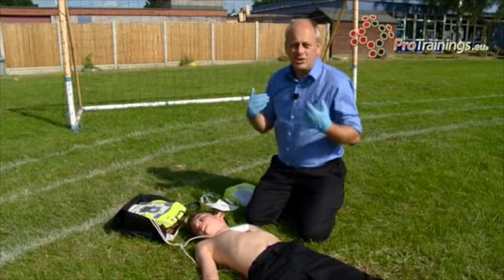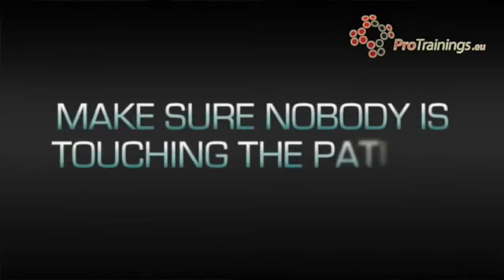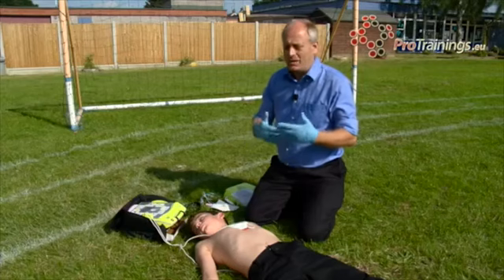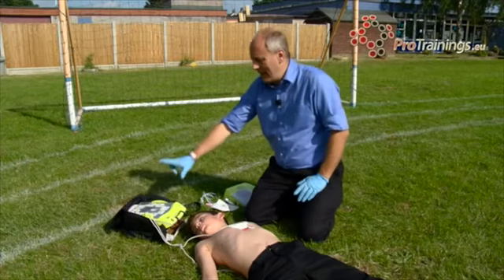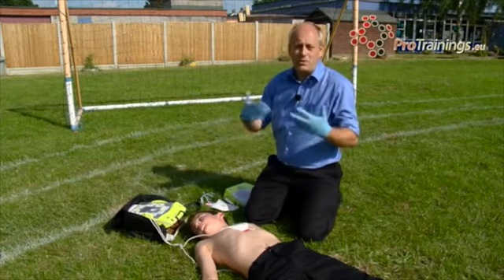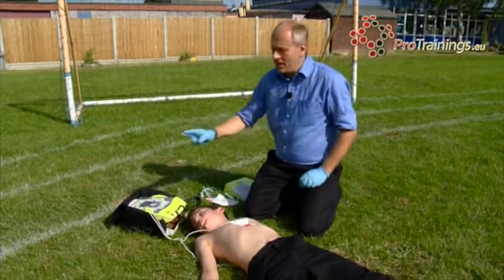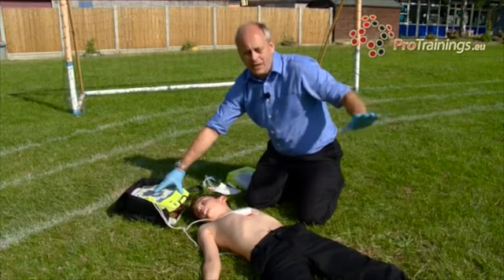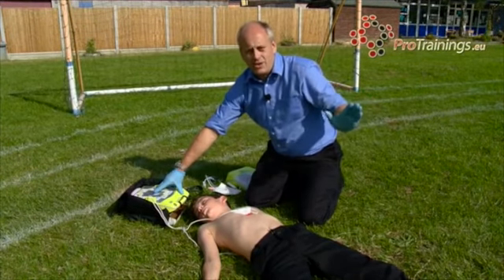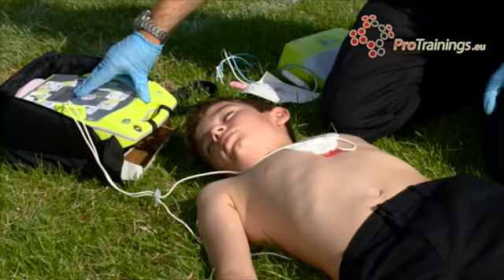If the unit does say a shock is advised, then what we need to do is make sure that nobody is anywhere near. The last thing we want to do is to be delivering a shock through the child and then someone touching them or causing any problems. Not only will that interfere with the analysing cycle, they could also pass the shock through them. So when we're dealing with this, we need to put your hand over. Now, most of the units will tell you to push the flashing button or direct you to where you need to go, and there'll be some kind of flashing light on it. So hold your finger over the button so you're ready, and then make sure that there's nobody else around you and tell everyone to stand clear, you're delivering a shock. And then to deliver the shock onto the child, just push the button.